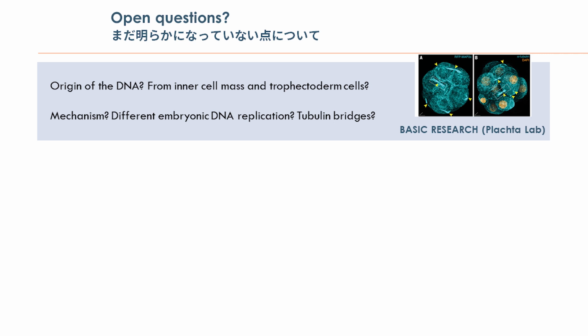It's difficult to find a good model for this, because when you use staining for the DNA, usually the embryos arrest in their development. It's not easy to have a good model, but we are getting some improvements on this. We will try to have some nice images for next year.